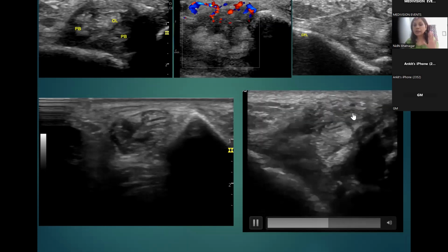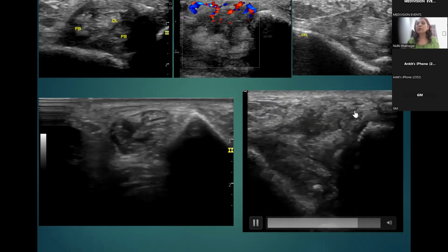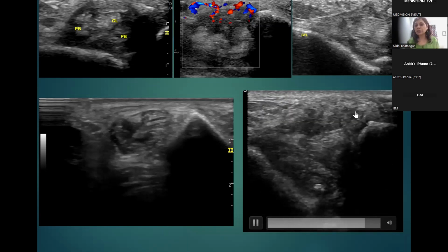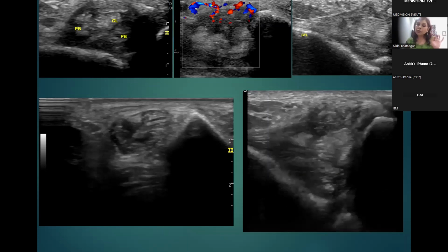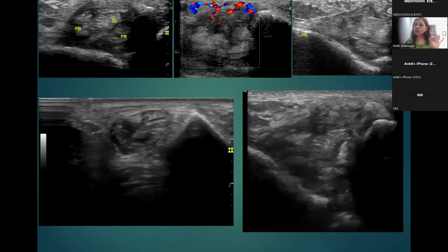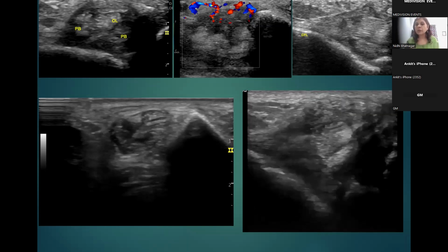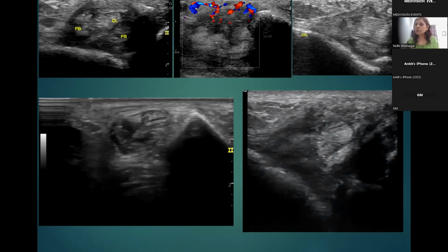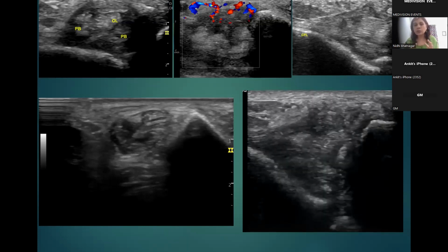So this was a grade 2 kind of injury where the SPR was avulsed and the fibrocartilaginous ridge was also taken away. We were unable to really demonstrate the dislocation of peroneus longus, but that could be because of the encasement of the entire peroneus brevis longus complex in this very thick synovial proliferation, which in that acute injury was probably just catching hold of them.